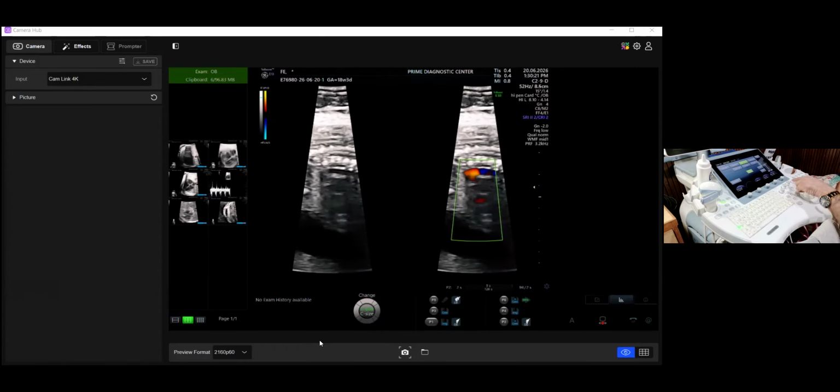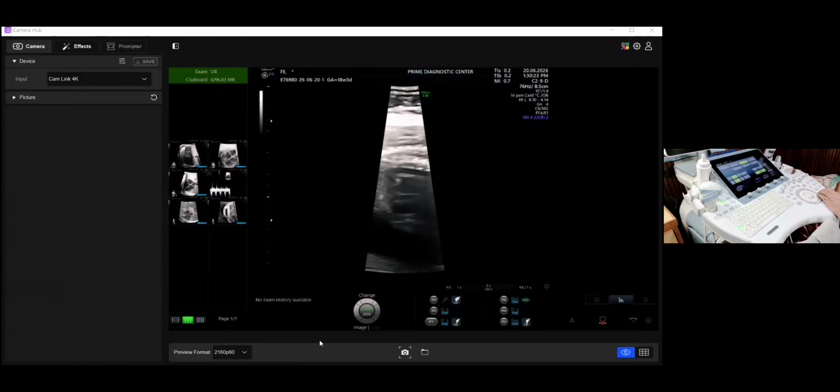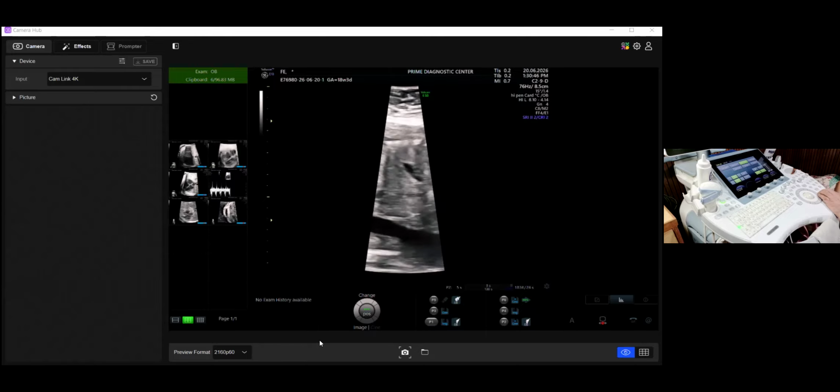Again, not a great window because the spine is anterior. Maybe we'll show tomorrow, in one of the positive cases, what we see. We might be able to see it when the fetus apex is positioned well. So that is the inferior vena cava you see.